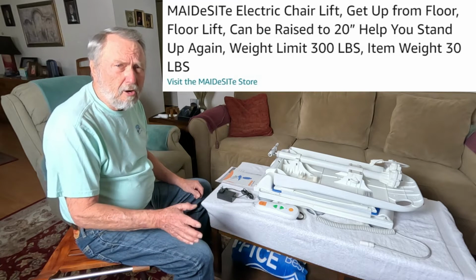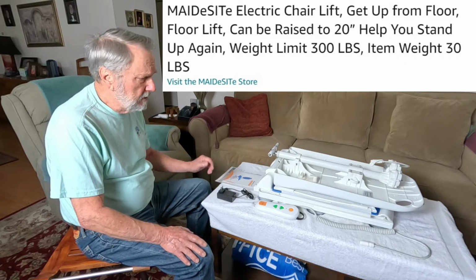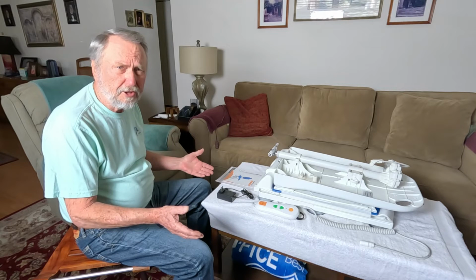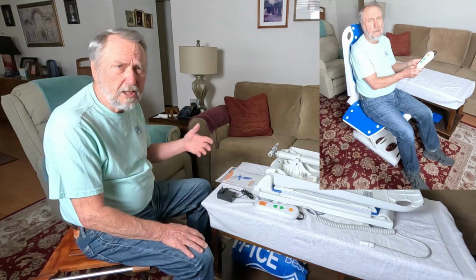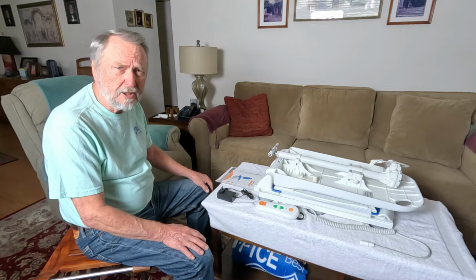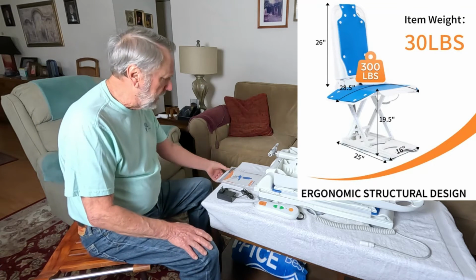This is a chair lift. For folks that fall on the floor and can't get up, this is a device that will be able to raise them from a fall position up to a sitting position, or it can lower them into a bathtub for a nice soothing bath and then raise them back up to a sitting position. So let's go through this and see what we get.